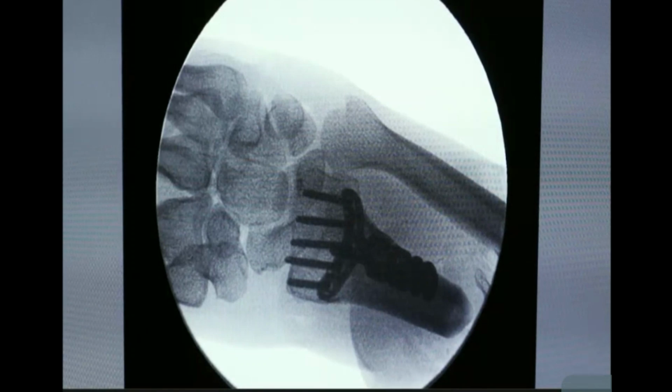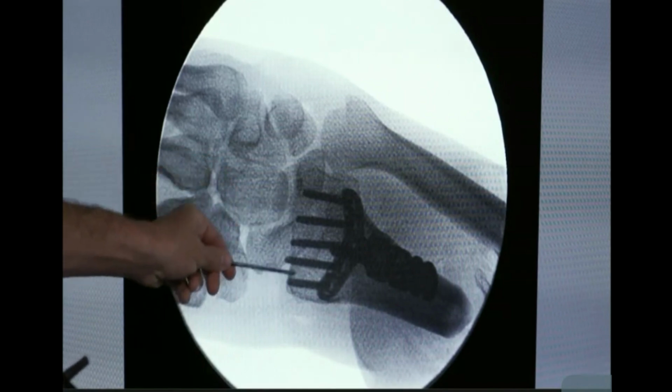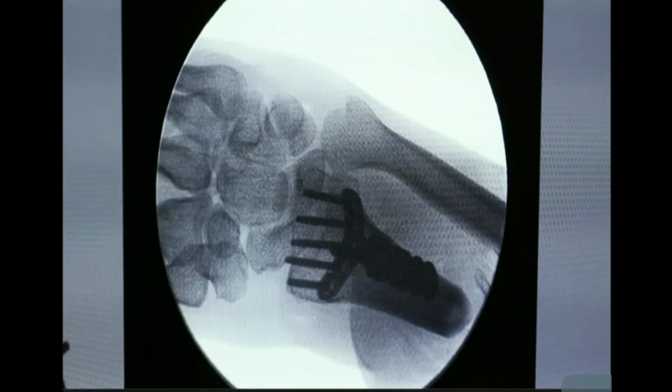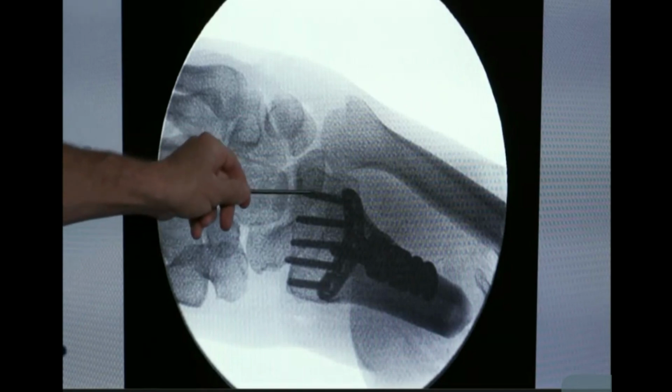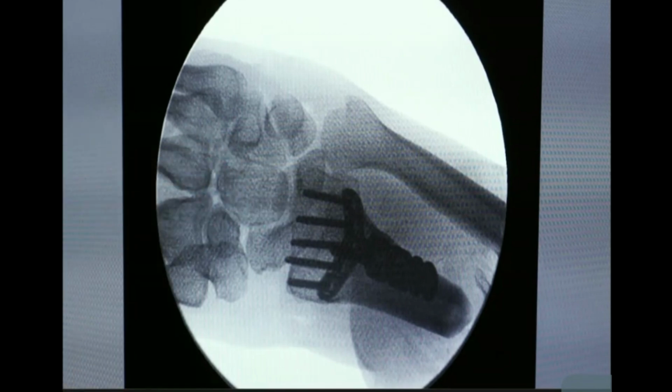This is an unusual view looking end-on, but it demonstrates some of the versatility of this plate. This allows us to form a scaffolding of parallel screws directly beneath the articular surface. And with these ulnarmost screws, we can get near the sigmoid notch down into that volar portion of the lunate facet, which is a notoriously difficult place to get from volarly.